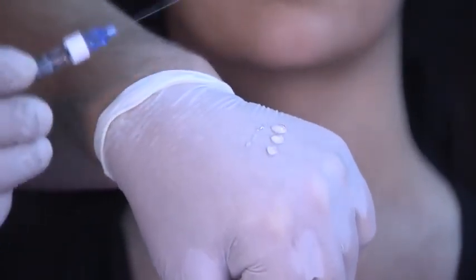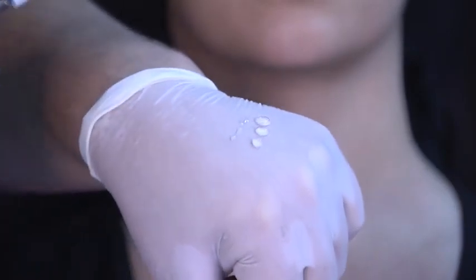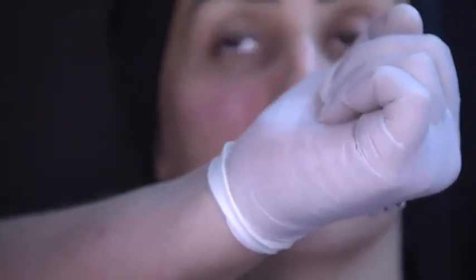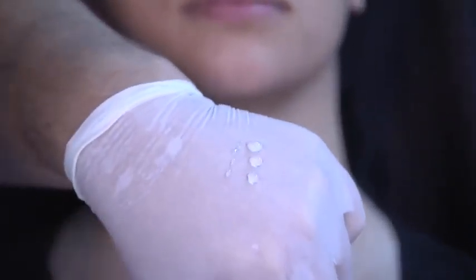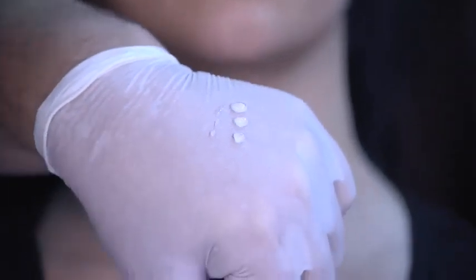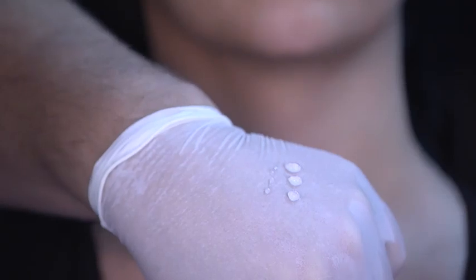Don't do it on the surface above the muscle unless you have someone with very dark skin, and especially when you have experience with the product under the muscle. The safe thing is to do it under the muscle. Look, this is still a cross-link product. It's 100% cross-link, and I know it's a skin booster, but I'm using it a little bit as a filler for this area. My experience is fantastic, but I tell you again, this is my personal recommendation.